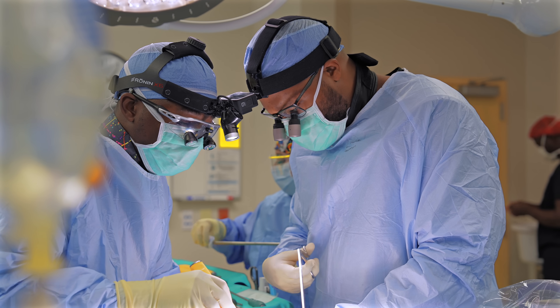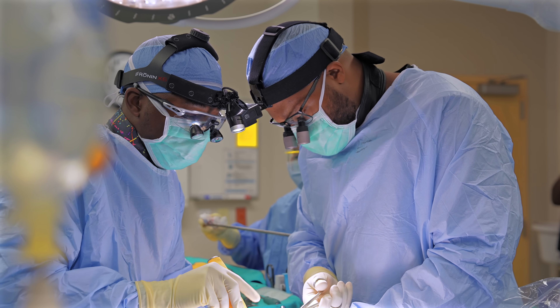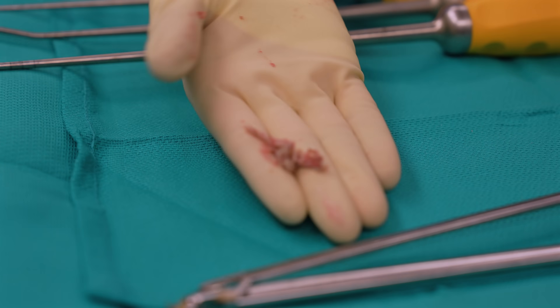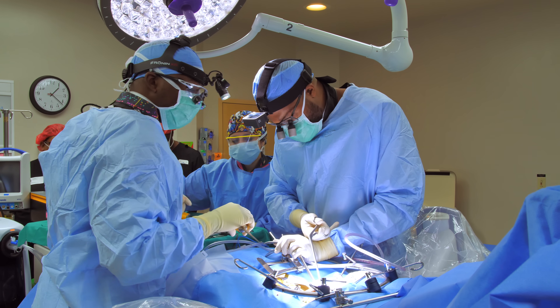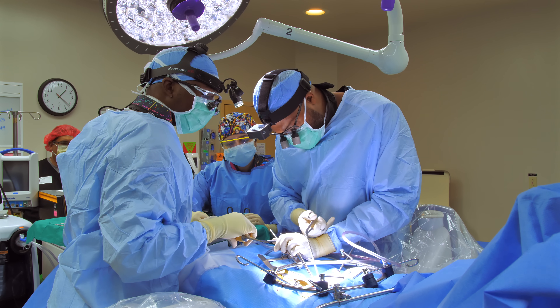We have a lot of specialized instruments that we're using now that are specifically designed to carefully work in this area — and here's a large piece of disc that I just pulled right off of her spinal canal there. This is a lot more collapsed and stenotic, tight, than the MRI showed.